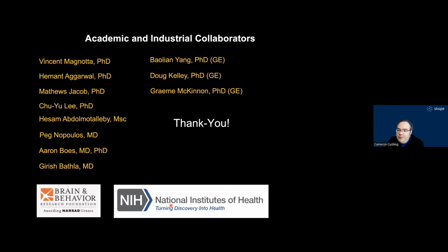Prashant. What is the minimum computing hardware required? I didn't use any GPUs or anything fancy, just a basic desktop that I have. As I said, the training is not at all computationally intensive, so nothing fancy. The model-based reconstruction is all done in MATLAB. The training was done in TensorFlow. Again, very modest hardware.